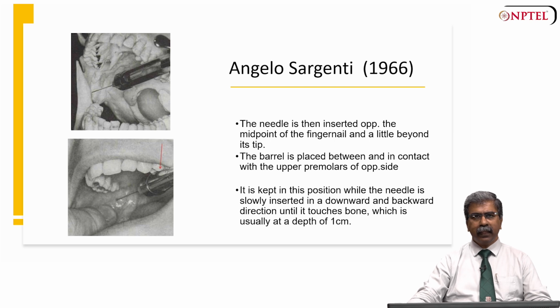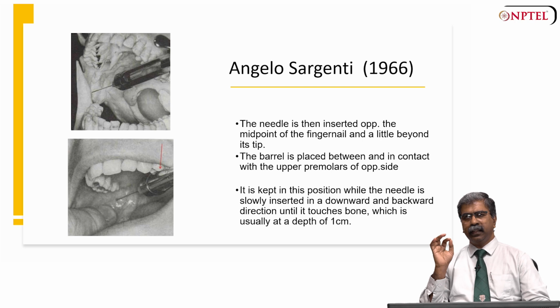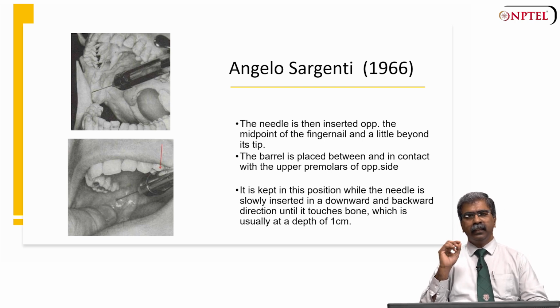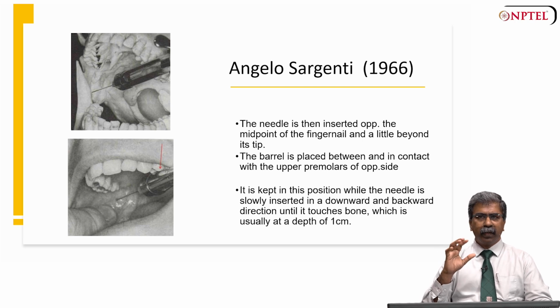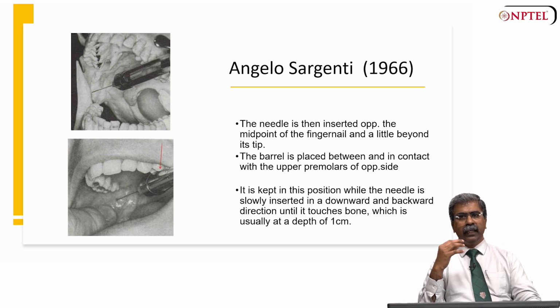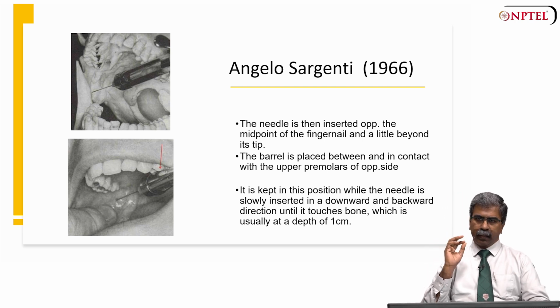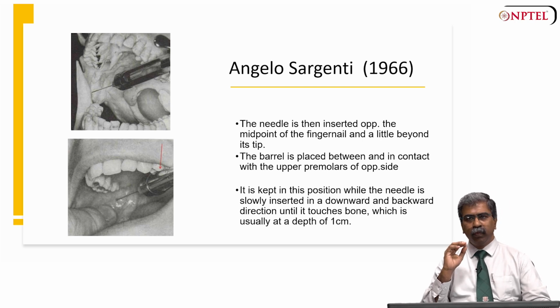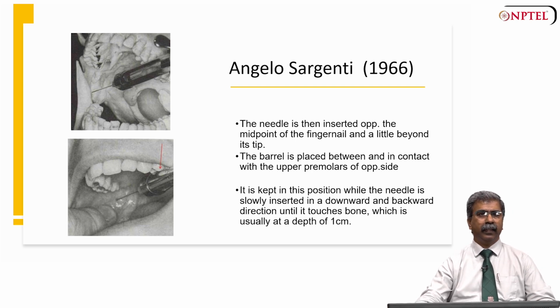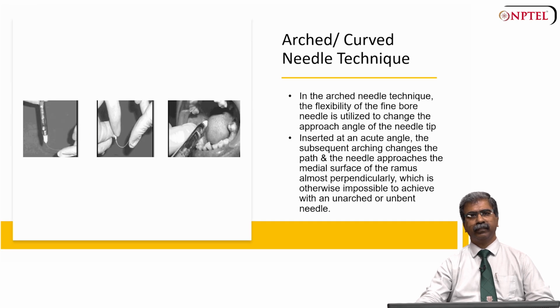The technique is that the needle is inserted opposite to the midpoint of the fingernail and slightly beyond the tip of the index finger placed at the retromolar fossa. The barrel is placed between the upper premolars of the opposite side of the mouth and maintained in contact with the teeth throughout the procedure. The needle is then advanced slowly in a downward and backward direction, moving towards the bone, and the bone is typically contacted at a depth of about 1 centimeter, ensuring that the anesthetic is deposited at the correct target site, as you can see in these images.